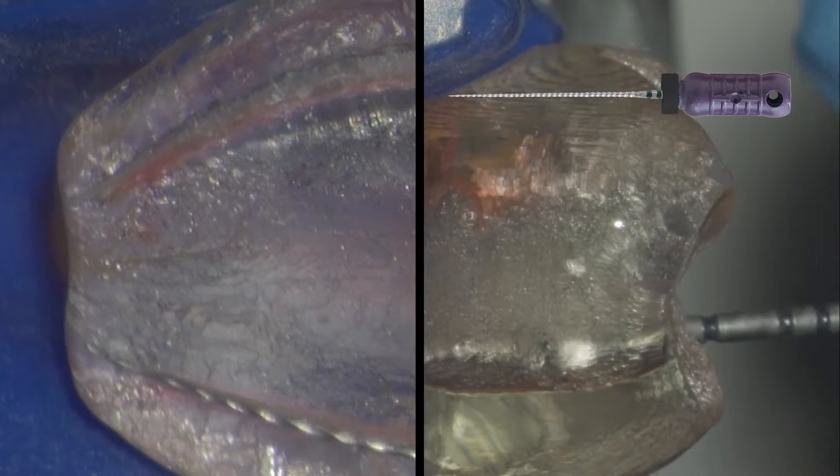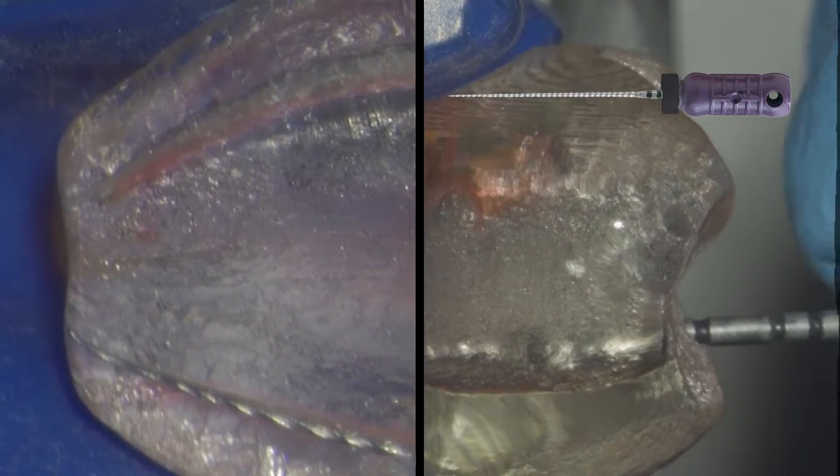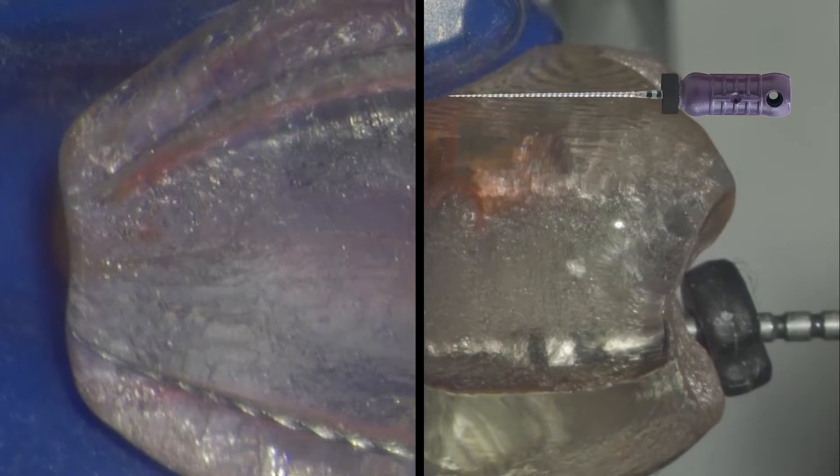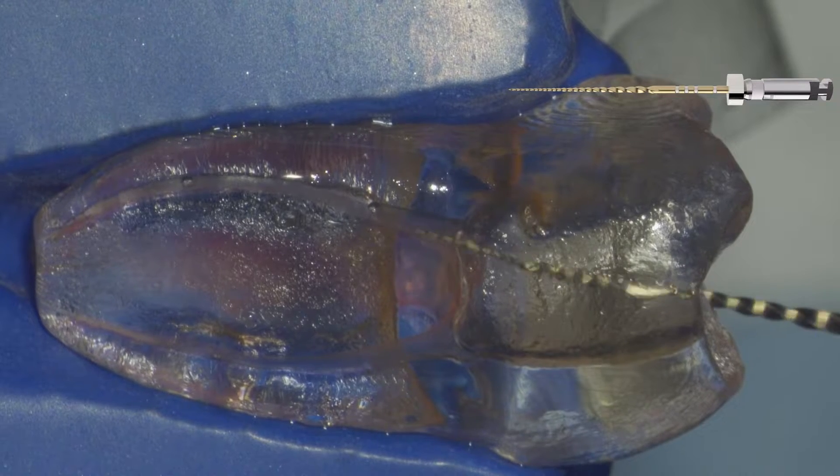Working length is confirmed with our electronic apex locator — as Chabahang reported, 96% accuracy back in 1996. After confirming working length, we want to make sure we rinse the chamber and irrigate the canal once more.